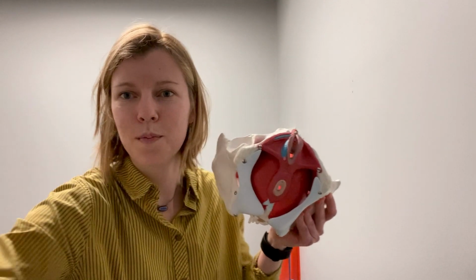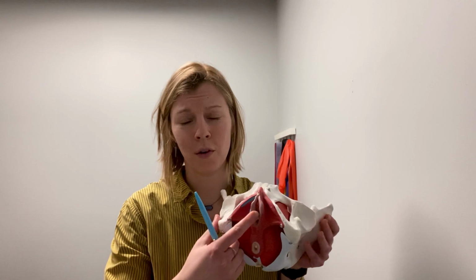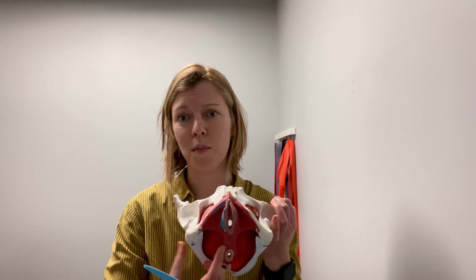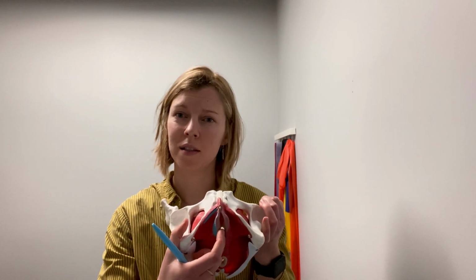dry needling. Yes, pelvic floor dry needling. A really cool tool. I'll show you some spots we typically hit. First thing to talk about is nothing is ever entering the rectal or vaginal canal. These are external techniques, though they often involve someone being undressed, and sometimes they involve a backdrop of a finger that is inserted vaginally or rectally.